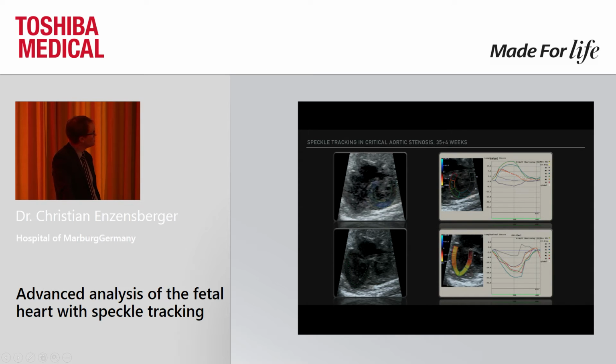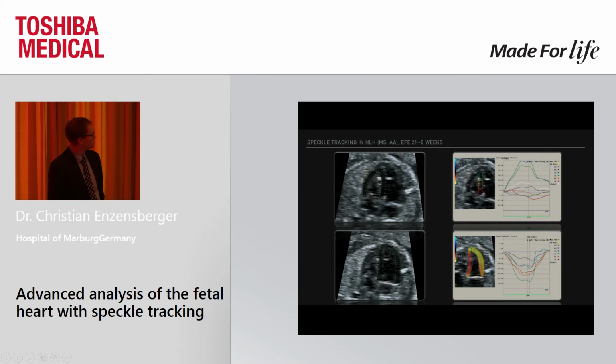So it seems that by this congenital heart disease, myocardial deformation is also completely changed, while the right ventricle shows more or less a normal movement of the myocardium. We have slightly lower longitudinal strain in this right ventricle, which is comparable to data which is published with other systems.